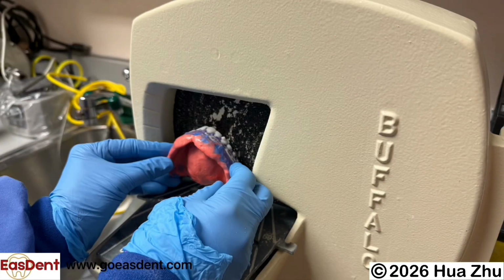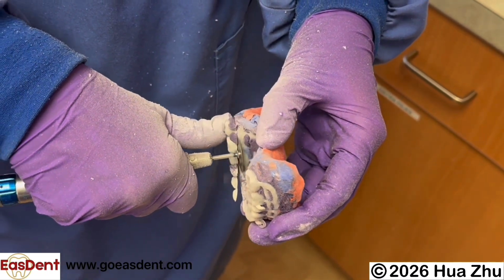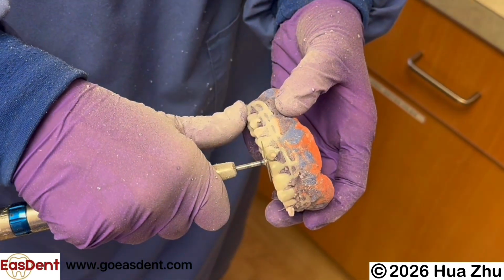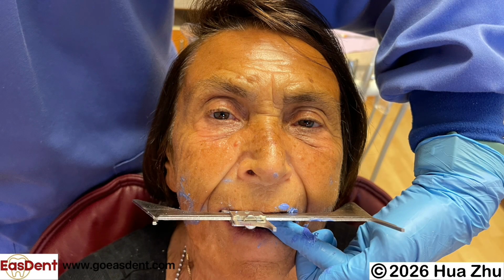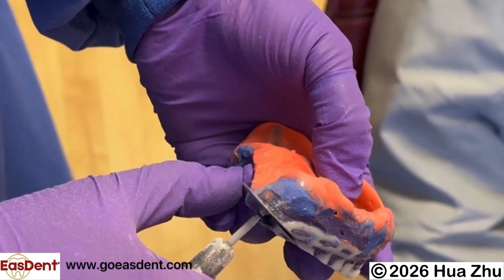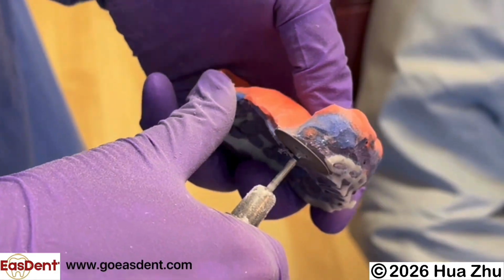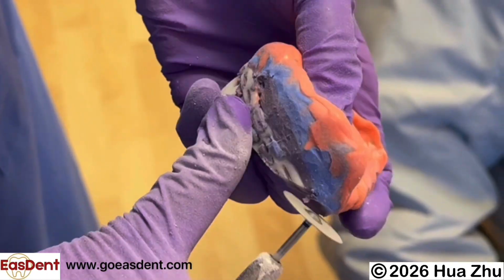You can also disinfect the maxillary Easdent impression and use the model trimmer to trim away from the occlusal surface. Try to not do the trimming of the anterior teeth too much because it may affect the aesthetic evaluation later. That is why I left a little extra impression material room when I use the putty PVS impression material to set up maxillary Easdent teeth. The second molar areas of the maxillary Easdent impression may affect catching a good impression of the retromolar pad areas. You can cut the second molar area away.